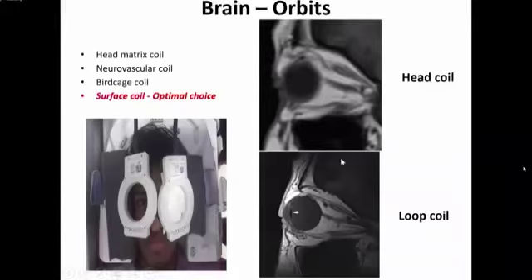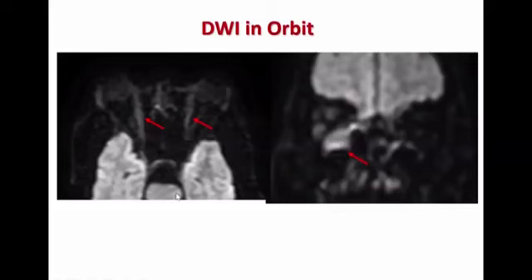will decrease with increasing distance from the coil, right? And there are orbits. You have several indications where they ask for MRI orbits or optic neuritis. There can be several complaints. Particularly, you do diffusion weighted images and calculate the ADC values and push to PACS.